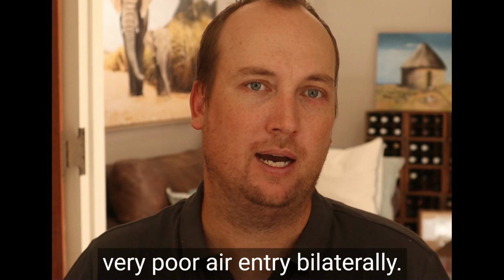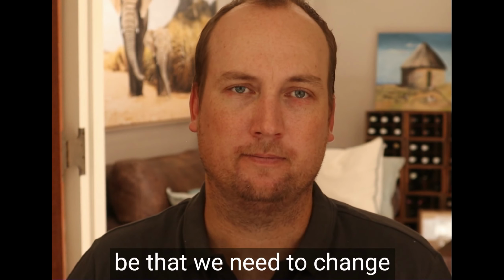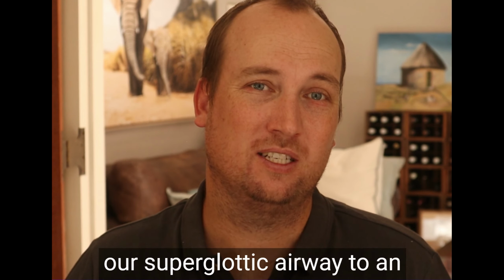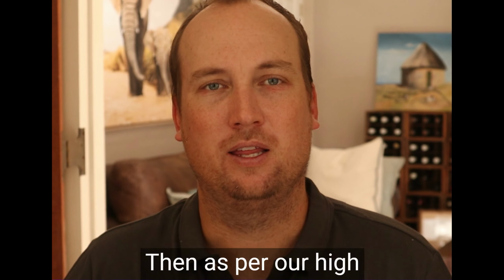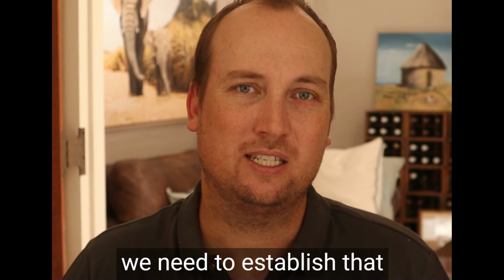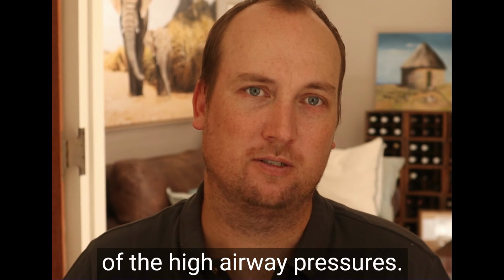If we listen to the chest, there will be wheezing on auscultation of the chest, or there may be very poor air entry bilaterally. Our initial management would be that we need to change our supraglottic airway to an endotracheal tube if we have a supraglottic airway in place. Then, as per our high airway pressure algorithm, we need to establish that bronchospasm is the cause of the high airway pressures.